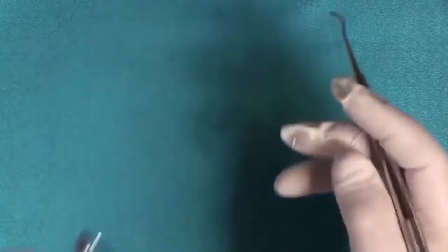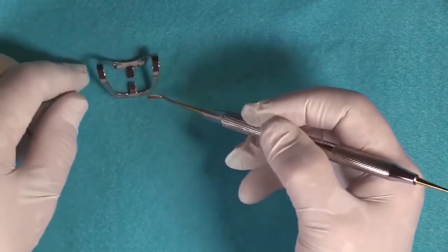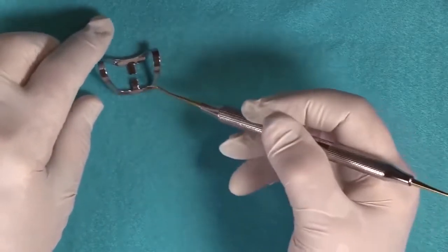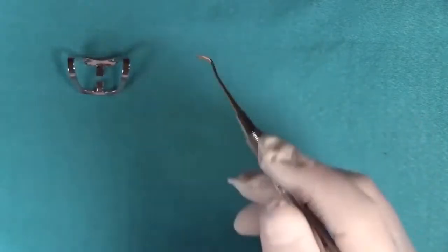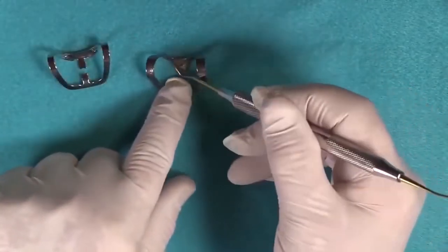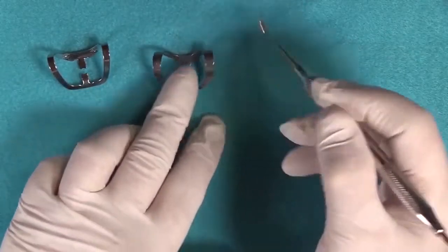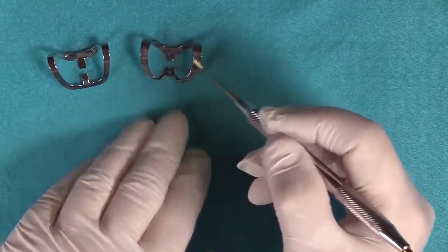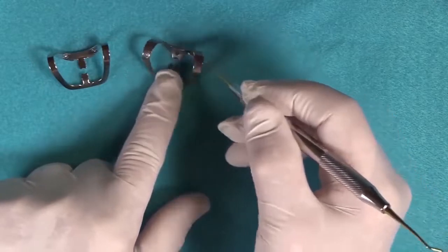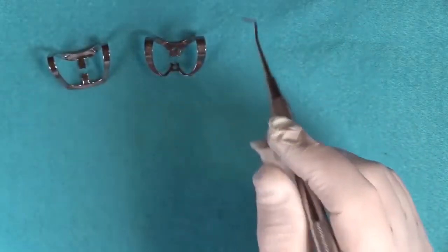Another one of Dr. Brinker's clamps is for gingival retraction when you have class 5 on the anterior part of the mouth. We'll discuss these in more detail a little bit later, because many people confuse the number 9 use. This happens to be a wingless number 9. By the way, the W stands for wingless. If you have a wingless number 9, you have to put the dam on the tooth first and then follow up with your wingless clamp, because there's no way you're going to stretch the dam over these bows.